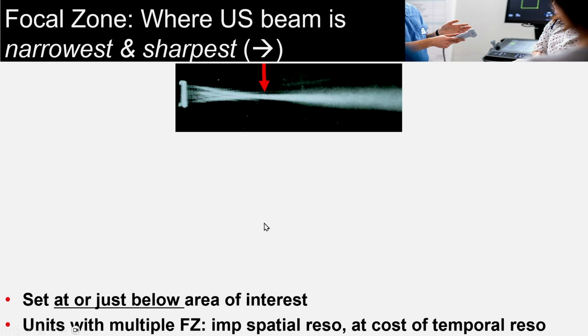Again, there are units with multiple focal zones available, but that will come at the cost of temporal resolution. I want you to learn to set it at the area of pathology or the structure that you're trying to evaluate. At or just below it will give you the best definition.